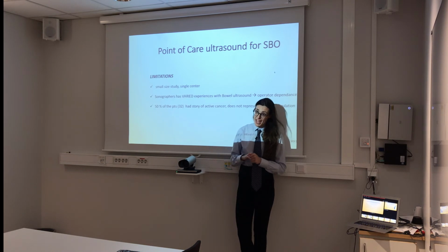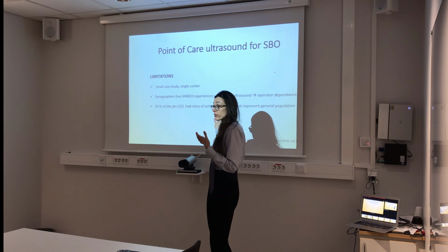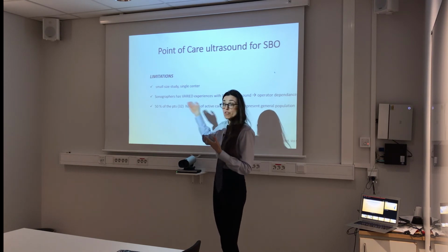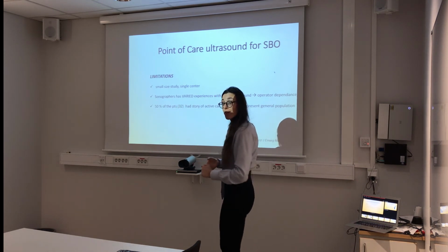Whoever is coming here with repeated events or a CT, the last one 3 weeks ago, you don't want to scan again. You know what I mean? Because you don't want to have a CAT scan because of radiation. So, which is still a good number of the population for me. Plus a little kid with an SBO due to intussusception. You got the reason why you treat the intussusception. You don't need to say why the patient has an SBO if it's very clear in the picture.